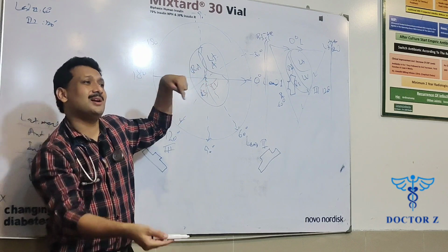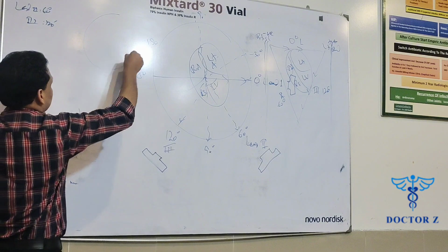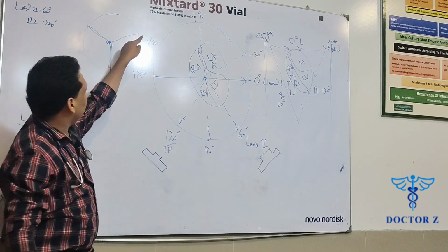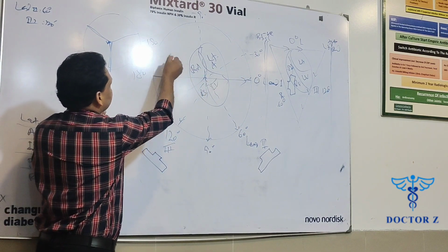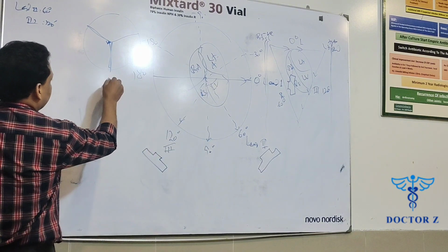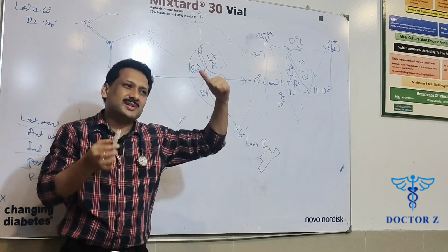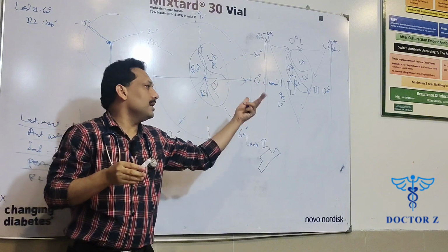Now we are going to divide the whole circle into 3 equal parts. So basically it's like that. This is the complete circle. I am dividing it into 3 equal parts. Now this angle is minus 30 degree. This angle is minus 150 degree, and this angle is 90 degree, right? So I am dividing it into 3 equal parts. Minus 30, minus 150. And on the basis of it, I am attaching 3 more cameras here. In other words, 3 more leads here.